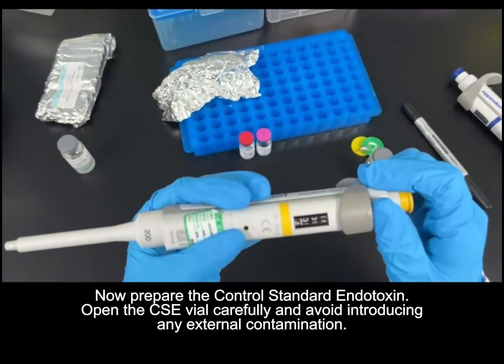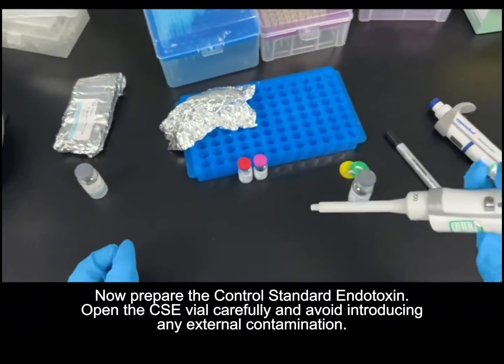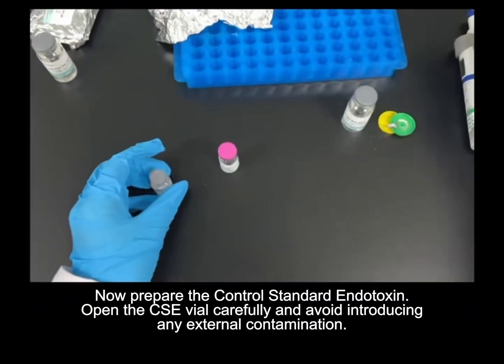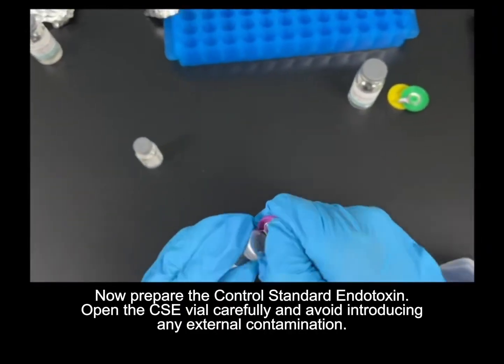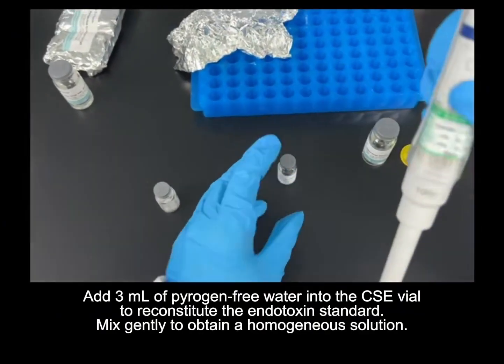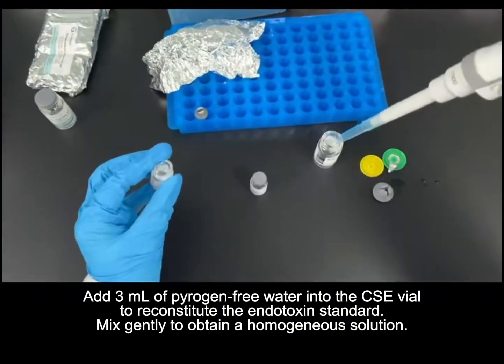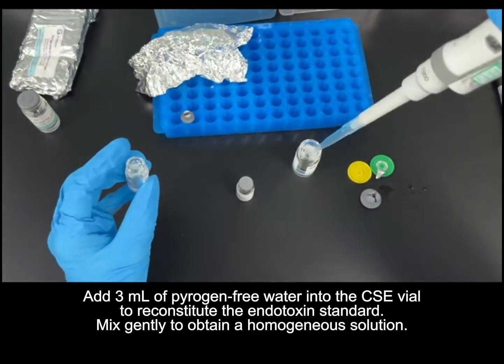Now prepare the control standard endotoxin. Open the CSE vial carefully and avoid introducing any external contamination. Add 3 ml of pyrogen-free water into the CSE vial. To reconstitute the endotoxin standard, mix gently to obtain a homogeneous solution.